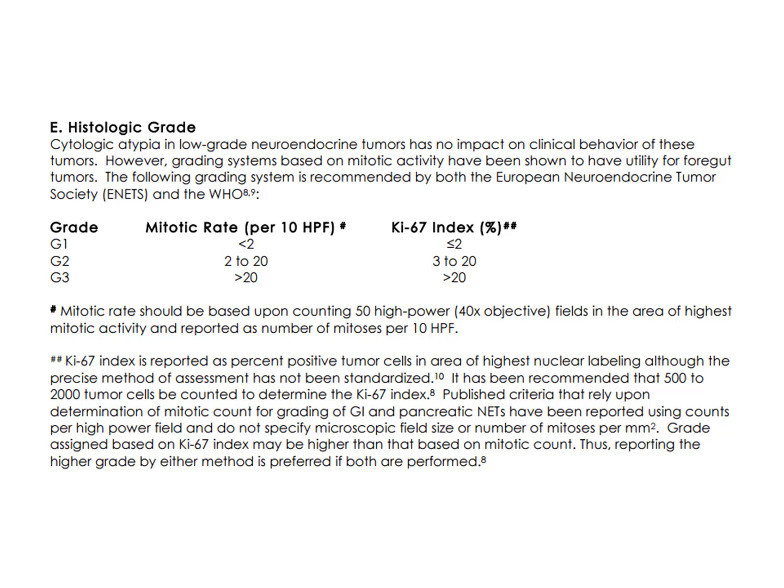In the past, neuroendocrine lesions with a mitotic rate beyond 20 were considered to be poorly differentiated. In the present system, as long as the tumor retains a neuroendocrine growth pattern, it should still be classified as well-differentiated. So now it is possible to assign a grade 3 to a well-differentiated tumor. In my experience, this is a rare occurrence.